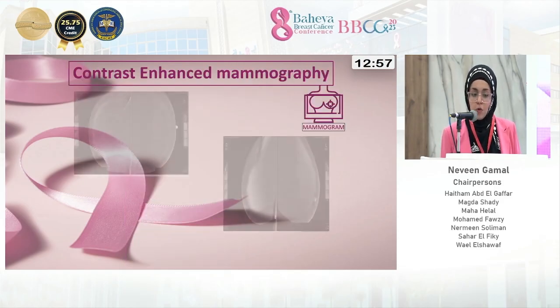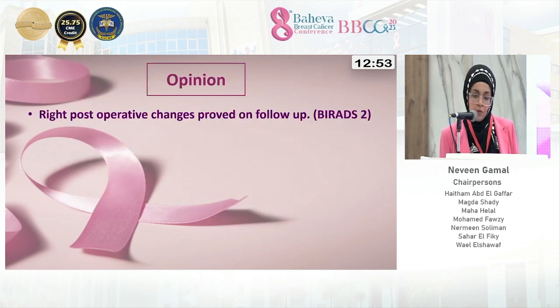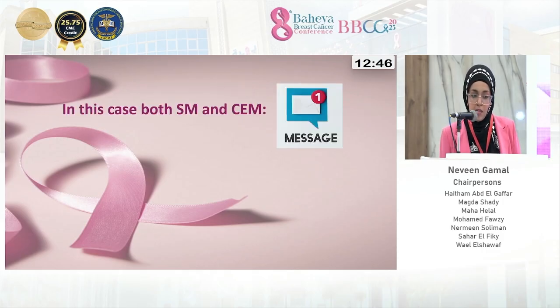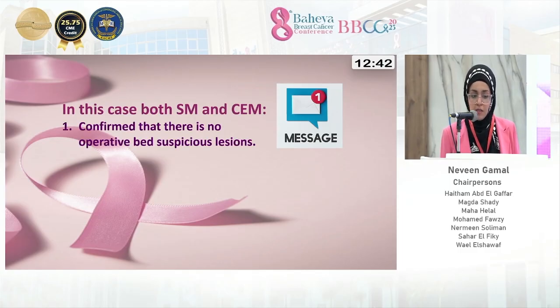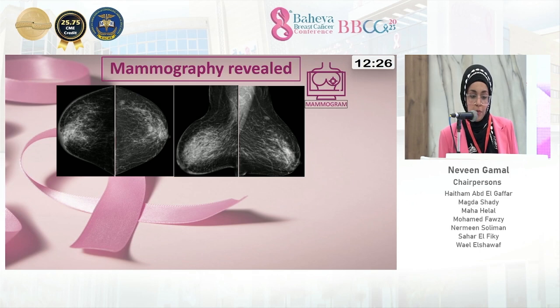Contrast enhanced mammography was done and revealed no enhancing lesions, BI-RADS 2. Our opinion in this case was right post-operative changes, proved on follow-up also, BI-RADS 2. And in this case, both sonomammogram and contrast mammography confirmed that there are no operative bed suspicious lesions and excluded contralateral lesions. Case number 3, 59-year-old female patient underwent right conservative breast surgery for invasive ductal carcinoma, presenting for follow-up.